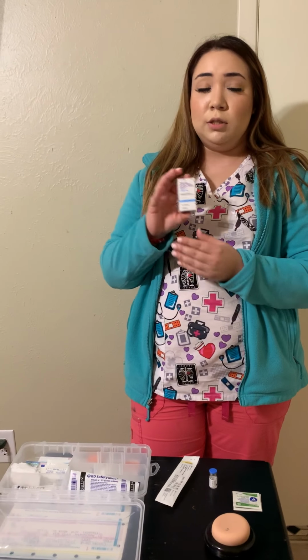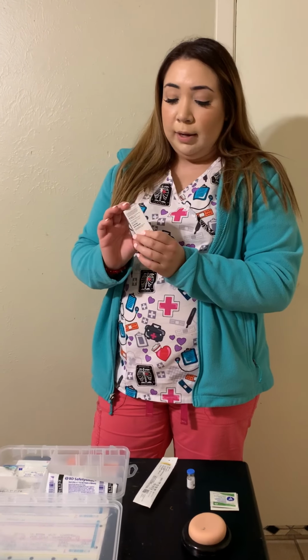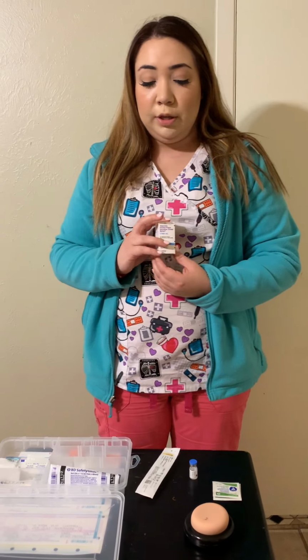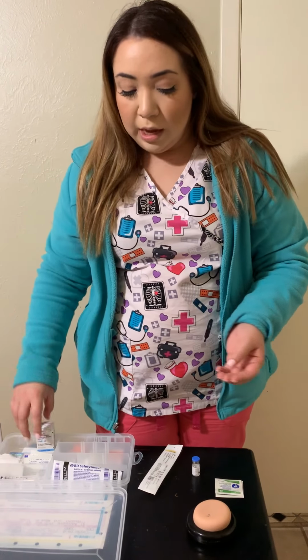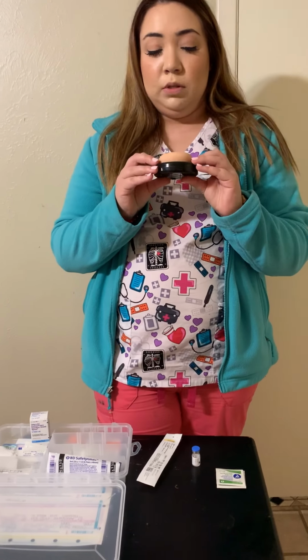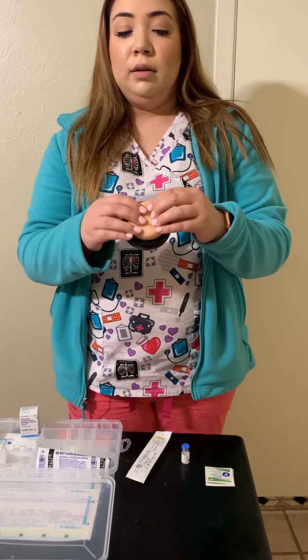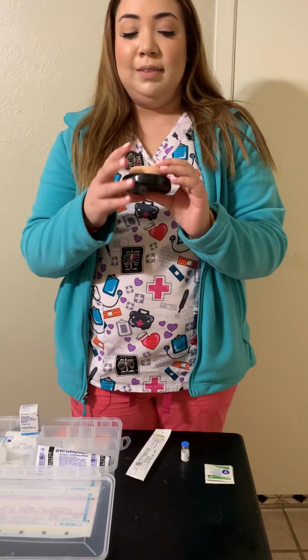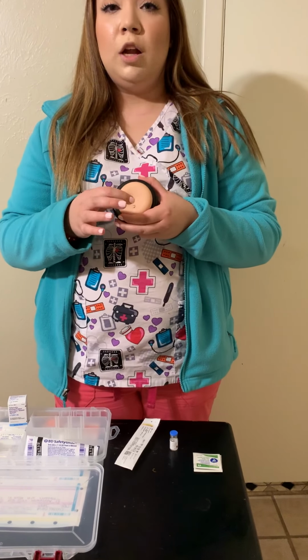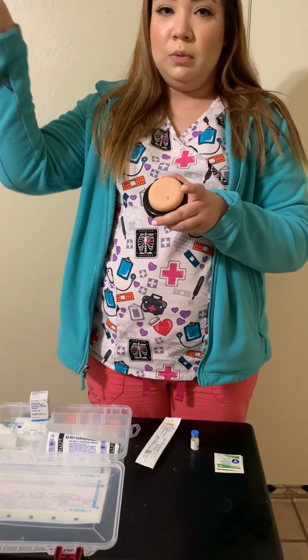Now, this vial contains 5 tuberculin units per 0.1 mLs, which is the 0.1 mLs we are going to end up administering. So I do not have an actual client, but I do have a skin simulation pad. So this is pretty equivalent to human skin. It does have a lot of punctures, again, from nursing school, so bear with me. The solution might end up squirting out.